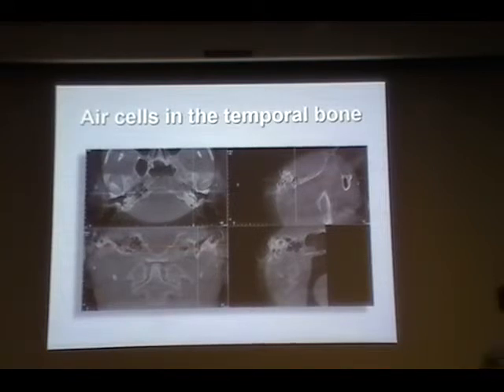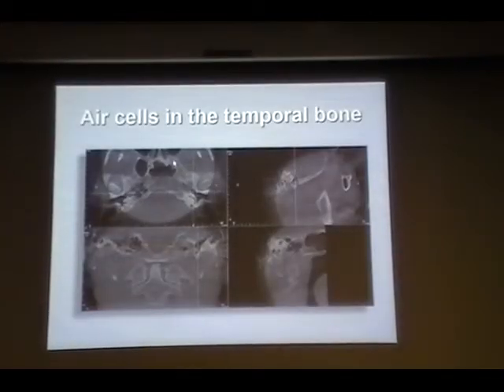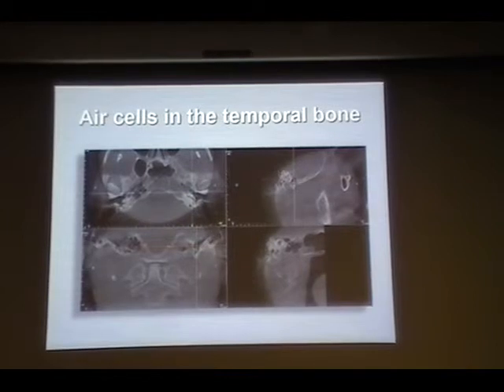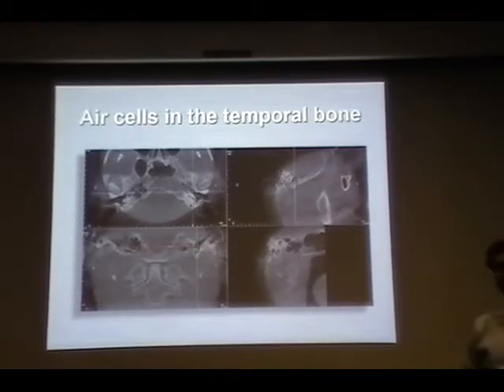And occasionally, you can also create a custom slice. For example, if you see this particular line, like this one, you can cut. You can take a slice like this, and then that slice is displayed on this part. So this is called a custom slice. You can cut however you want, like this, like this, or like this.